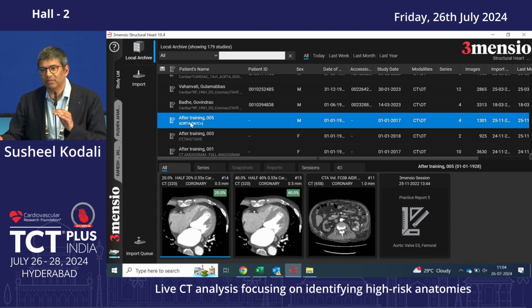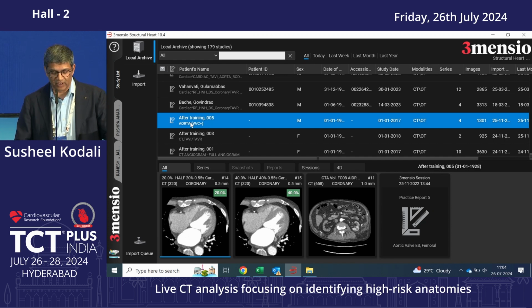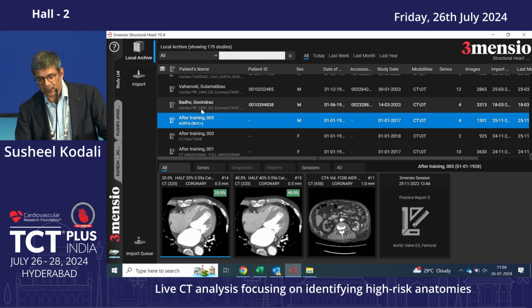I do think it's important that if you're doing a TAVR or a TAVI, you look at the anatomy, because how the TAVI device interacts with the annulus is really quite different in one valve versus another, and that's what predicts outcomes: stroke, PVL, root injury, significant complications.